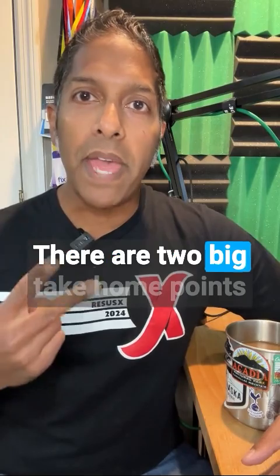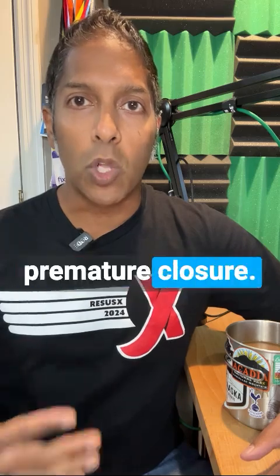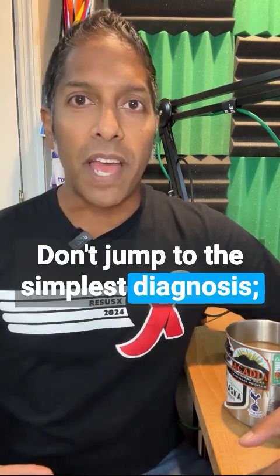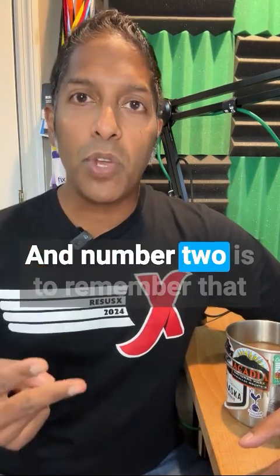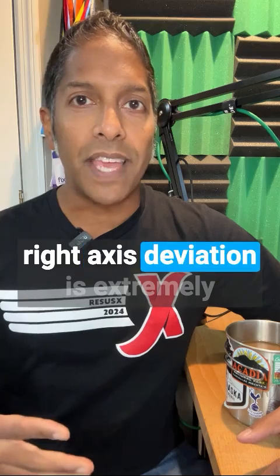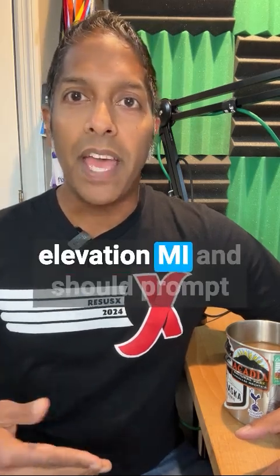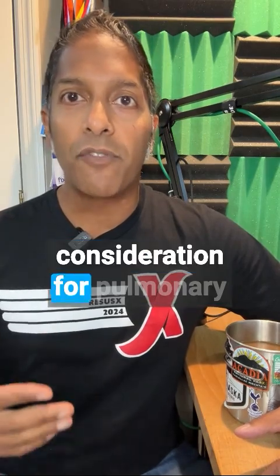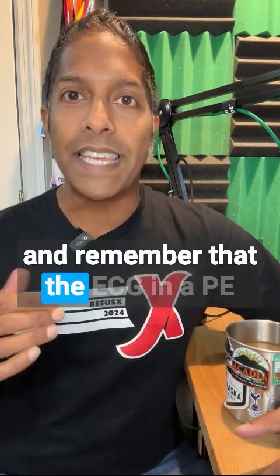There are two big take-home points from this case. Number one is to avoid premature closure. Don't jump to the simplest diagnosis. Keep your mind open to alternates. And number two is to remember that right axis deviation is extremely uncommon in patients with ST elevation MI and should prompt consideration for pulmonary embolism in patients with shortness of breath and chest pain. And remember that the ECG in a PE can mimic STEMI.